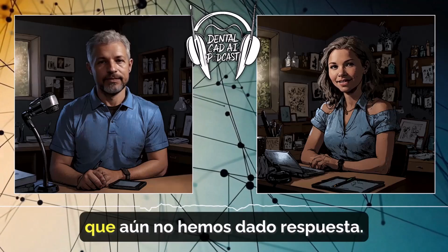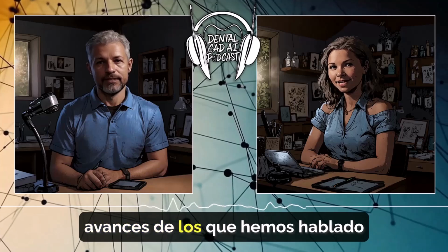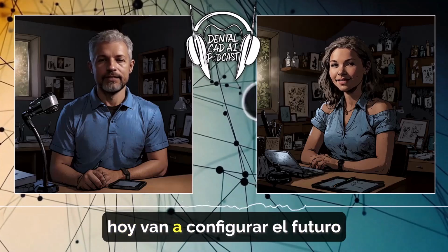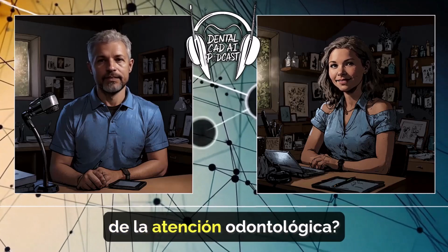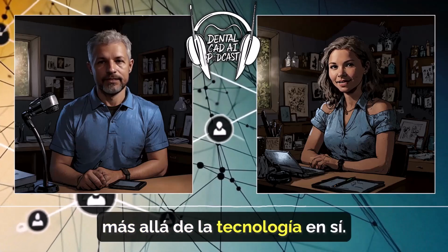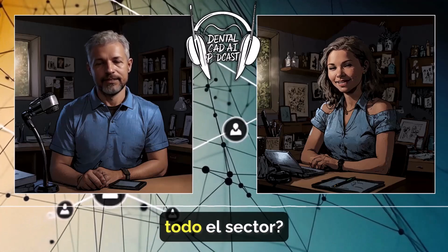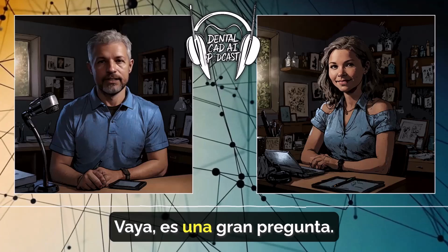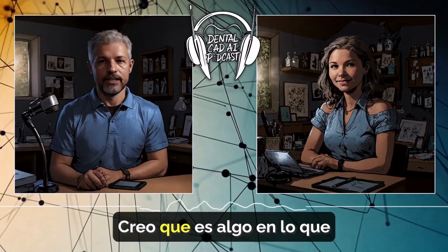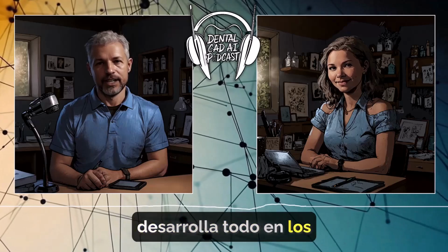All right, so we've covered a lot of ground today, but there's one big question that we haven't really answered yet. How do you think all these advancements that we've talked about today are going to shape the future of dental care? And I want you to think big picture here, beyond just the technology itself. What does this mean for patients, for dentists, for the entire industry? Wow. That's a big question. It is. I think it's something we all need to be thinking about. For sure. It'll be interesting to see how it all unfolds in the coming years.